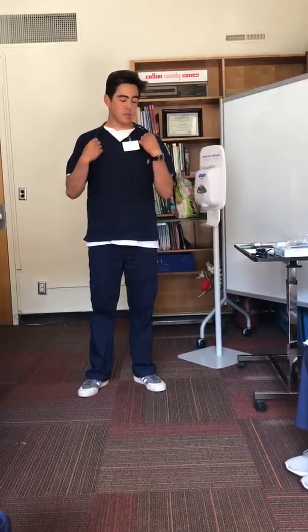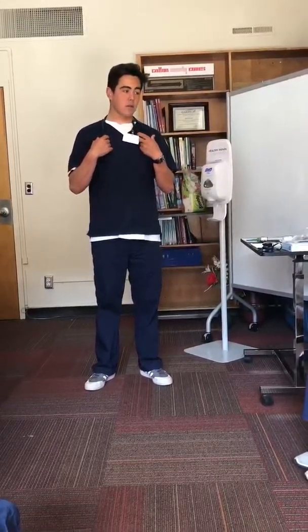Today we're going to be going over the small volume nebulizer competency. So the first thing we want to do is review the patient's chart for the treatment details. So we want to review the medication, the dose of medication, the frequency, and then the route as well. So this one's going to be a small volume nebulizer, a unit dose of 2.5 milligrams of albuterol through the small volume nebulizer just once right now as needed.